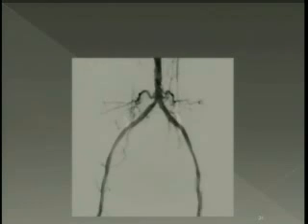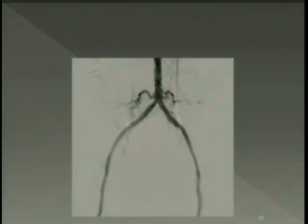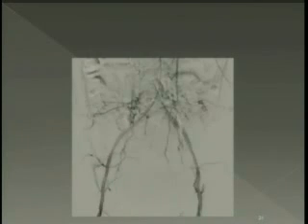Vis-a-vis comparison, say, of aorta-iliac bypass grafting. You speak for carotid, or for... Like in this particular case, when two self-expanding... You're talking of iliac, right? Iliac or carotid? No, I am talking about the iliac, type D aorta-iliac disease, and putting a self-expanding stent like Dr. Hiramat has done, and most of us do go ahead with the self-expanding stent.